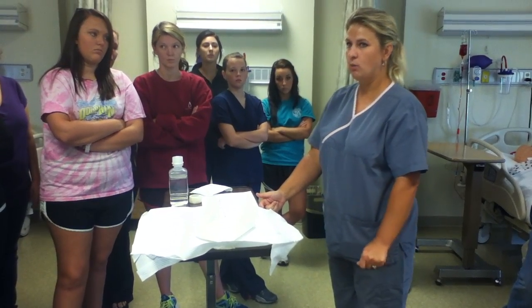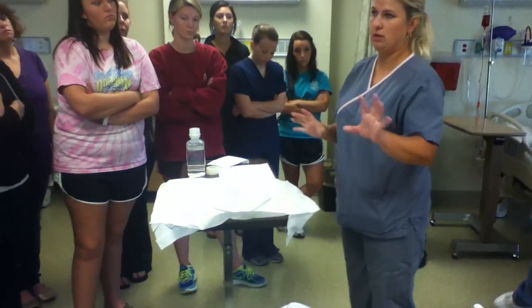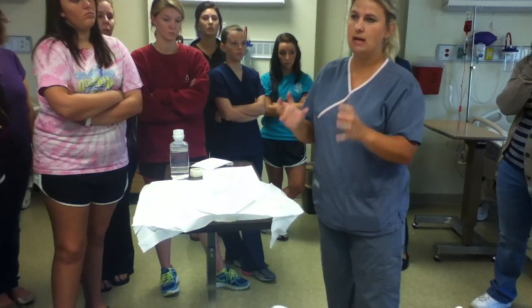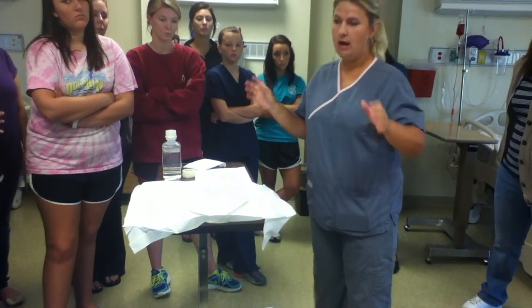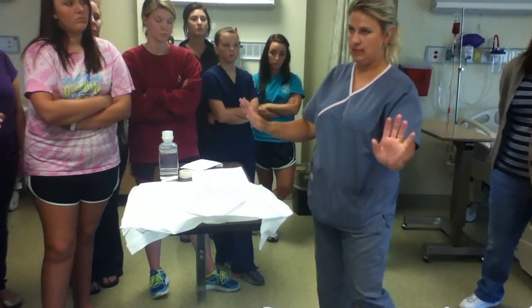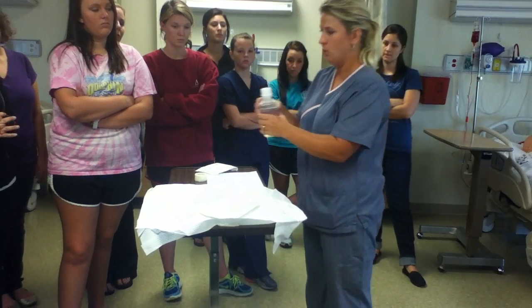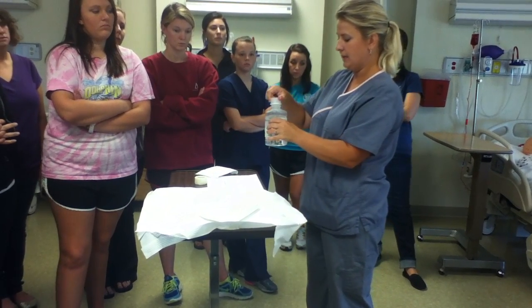Try to work in the middle, because just try not to get too close. Just keep your stuff centered, that way you don't get near it. Now, I cannot do this and grab anything because I cannot see it. Okay? So the next thing I'm going to do now is open my bottle of saline.